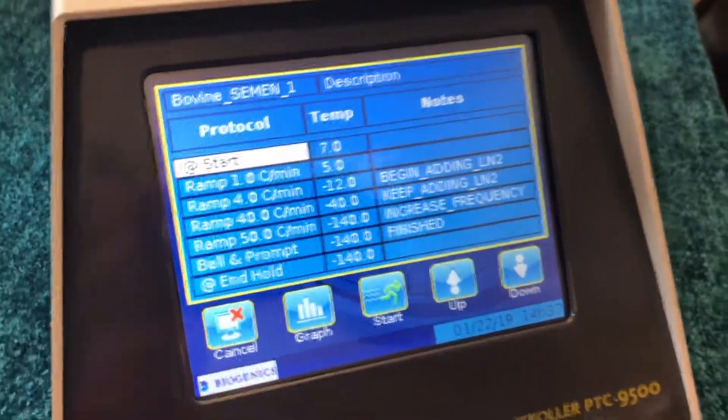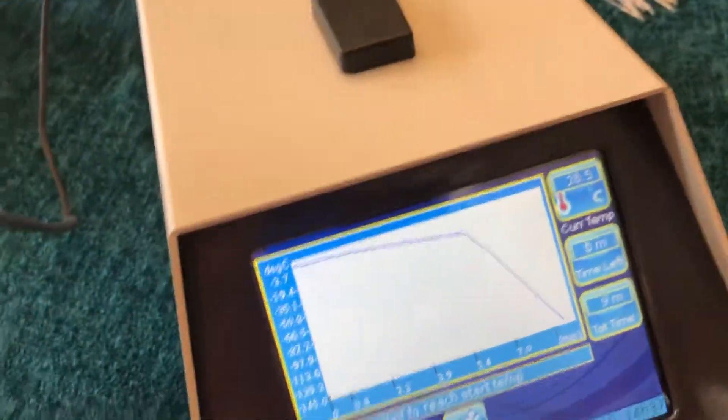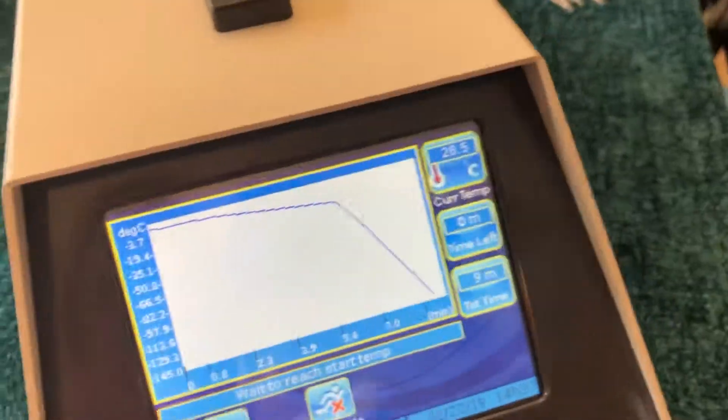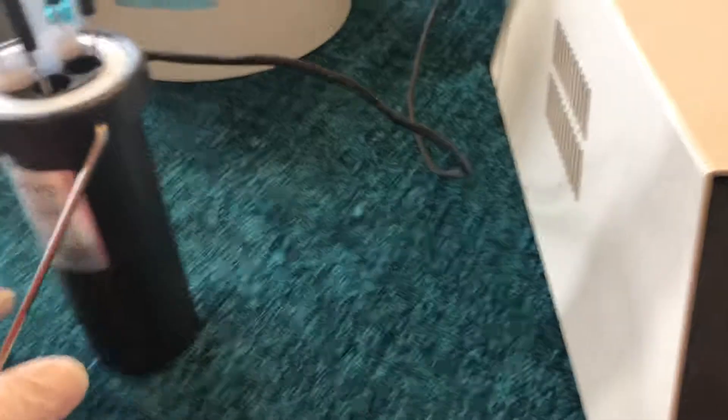All we have to do now — and it doesn't really matter when — is push Start, and it's going to say 'Wait to reach start temperature.' This is a safety feature: you cannot start the program — the icon is missing — until the freezer is actually at the starting temperature.